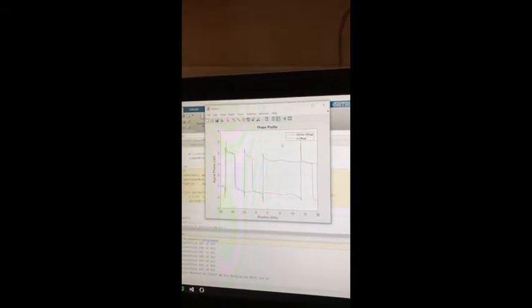Gradient versus time is of course the same. This is the RF versus time. This time, as we multiplied with a pure exponential, you see the imaginary and real parts, and of course the absolute one with the yellow line. This is the MZ profile, the phase profile. As you can see, the phase profile is completely changed. This is because of the exponential. And this is the magnitude profile.